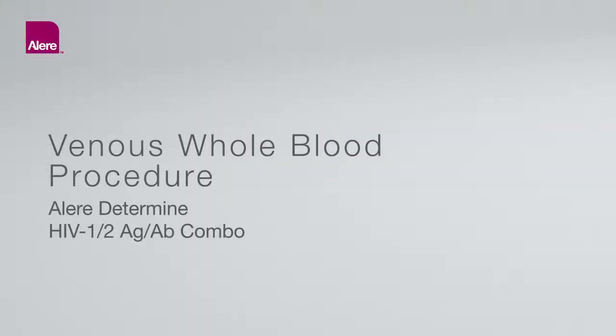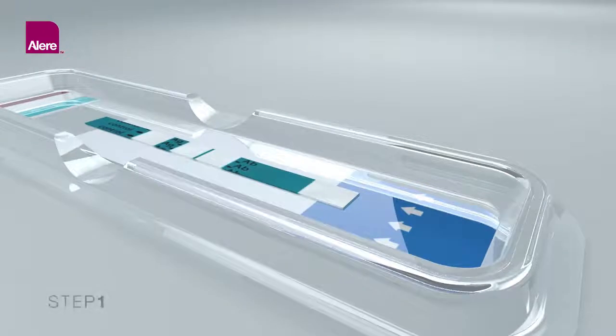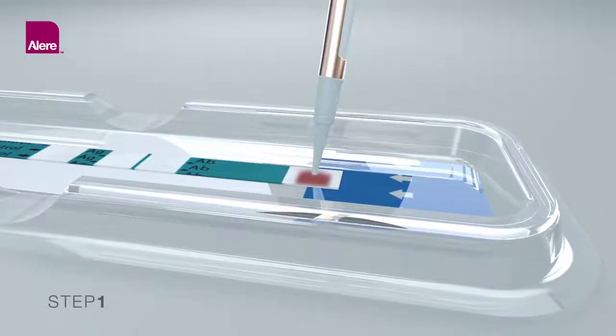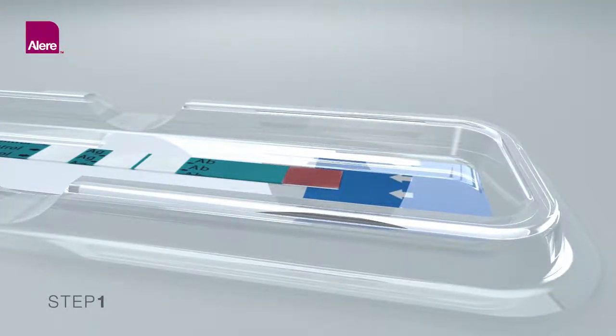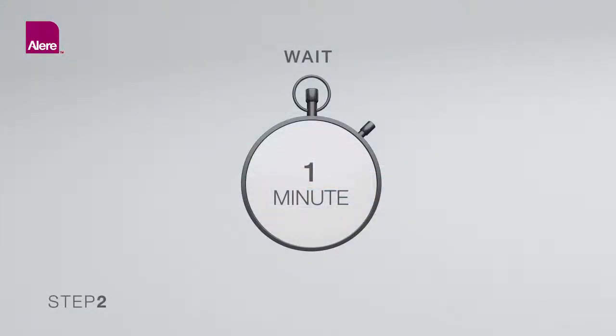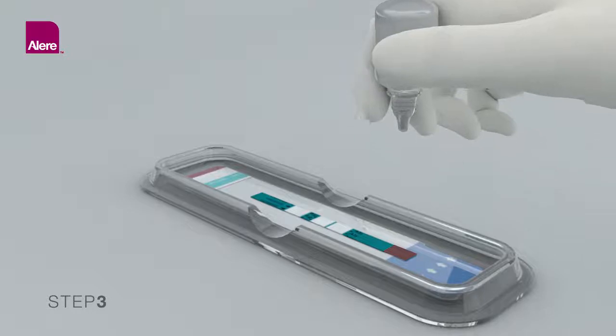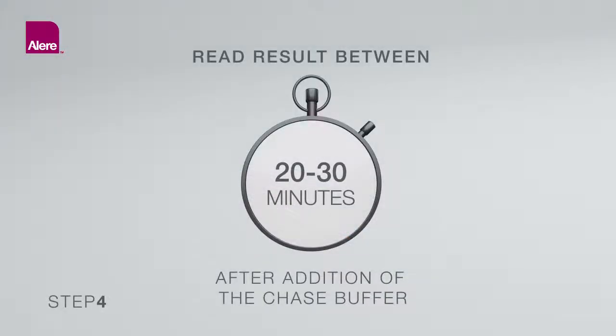Venous Whole Blood Procedure: Using a precision pipette with a disposable tip, apply 50 microliters of whole blood by touching the tip of the pipette to the sample pad, marked by the arrow symbol. When all of the blood is transferred to the sample pad, wait one minute to ensure the chase buffer does not overflow the sample pad. Then add one drop of chase buffer to the sample pad. Read the test result between 20 and 30 minutes after the addition of the chase buffer. Do not read the test results after 30 minutes.